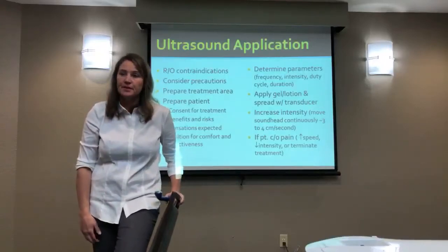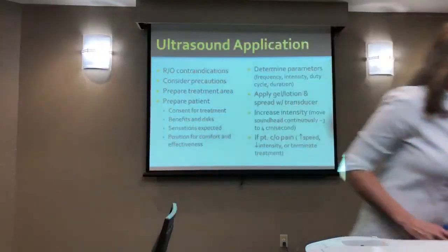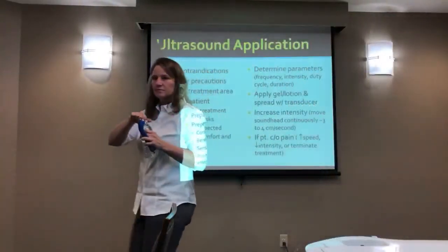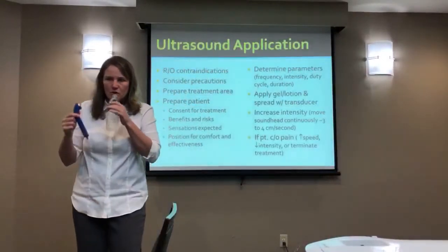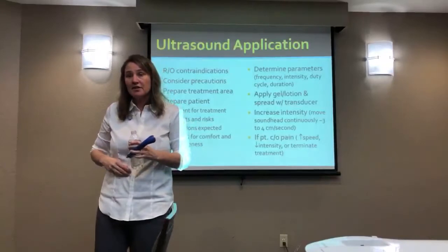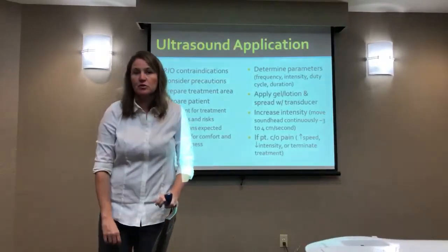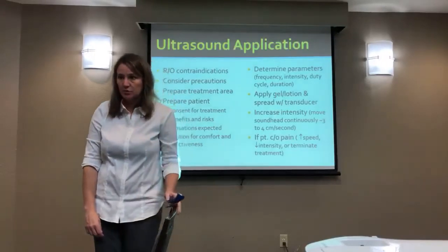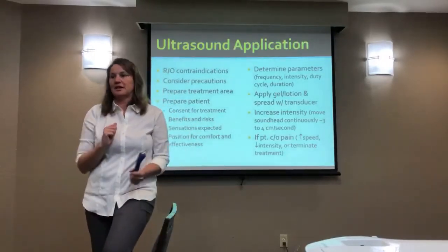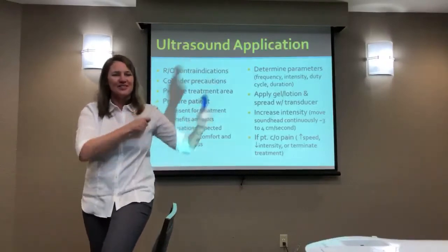Yes? No. I was thinking about cleaning it. My facility uses bleach wipes or the other wipes. Is it a good idea to wipe it down before you use it, let it dry? You definitely want to have a cleaning method. And in a perfect world, you would sanitize it. It would be cleaned and it would be covered, and it would be labeled as sanitized. And when you approached it, you would know that it's ready to go.